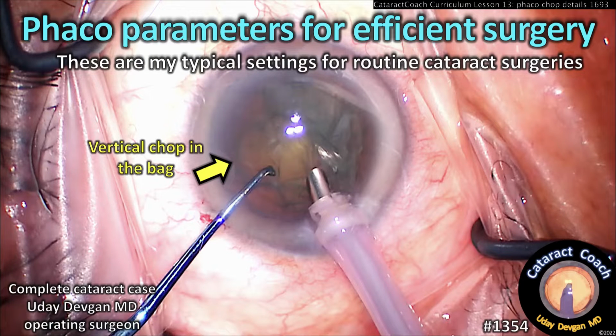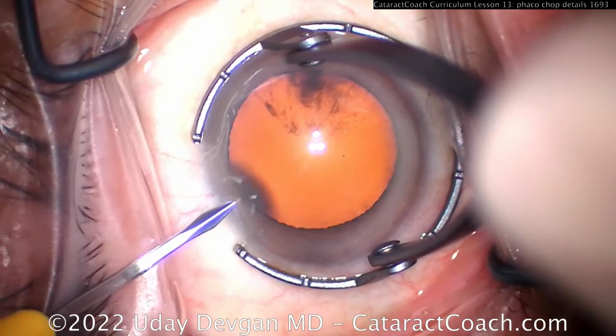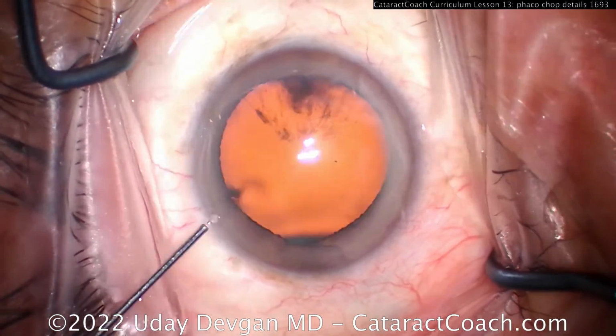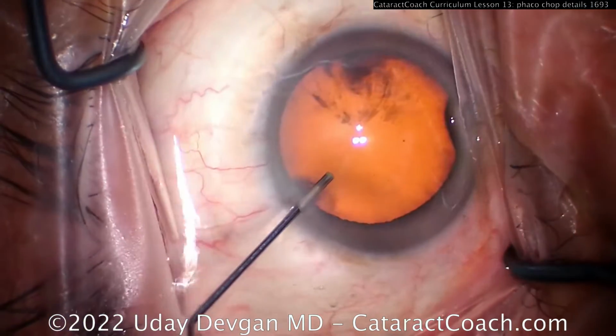CataractCoach.com, Phaco parameters for efficient cataract surgery. So these are my typical settings for routine cataract cases. Now I get asked all the time, can you please share with me what are the Phaco settings used for this case? As if there's some magical numbers that you don't know about.